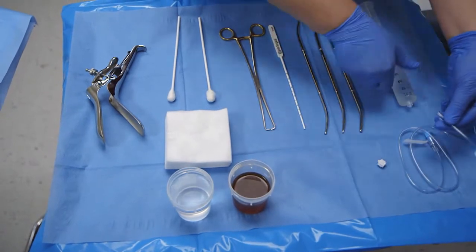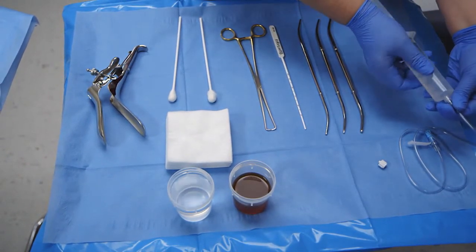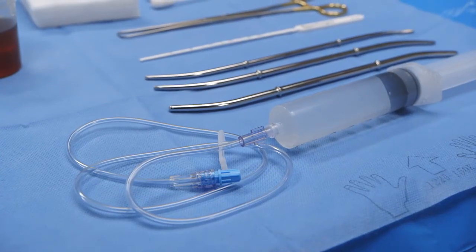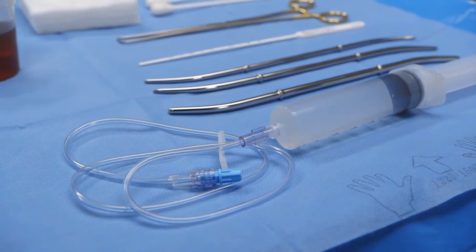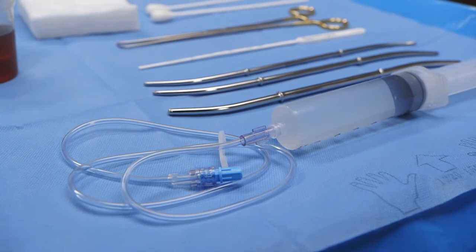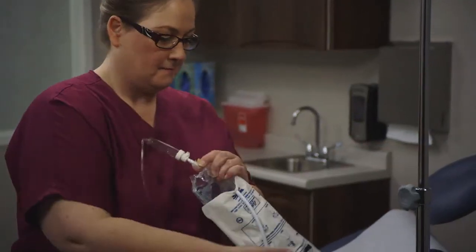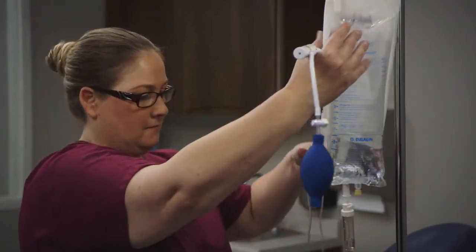Sterile saline can be infused with either a syringe or an IV bag with appropriate tubing. For saline infusion, you can use a 60 cc syringe with about three feet of extension tubing and a basin of sterile saline, or you can use a bag of saline hung on an IV pole with a pressure cuff. EndoC is all-in-one, so you don't need an external light source, camera, monitor, or system for photo and video capture. EndoC alone does it all.